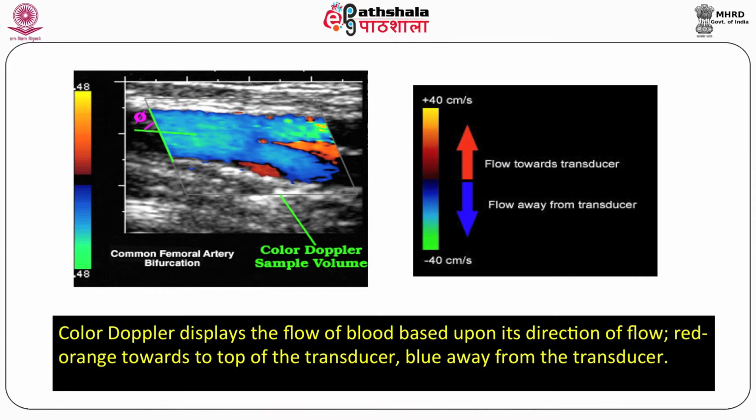That is number one disadvantage. Another disadvantage is that PRF limits the Doppler shift frequency that can be detected. It is angle dependent flow information, and moreover it has a high cost.